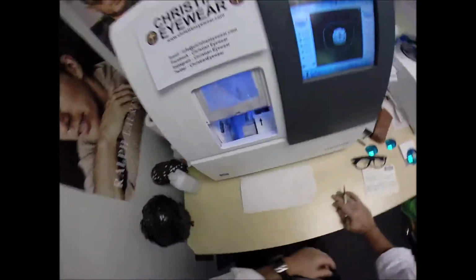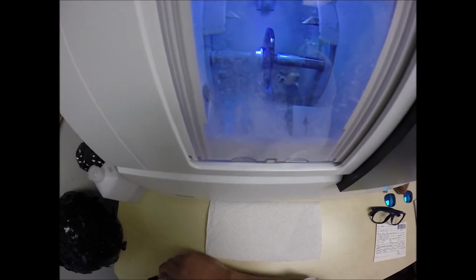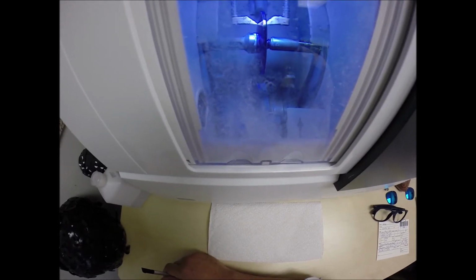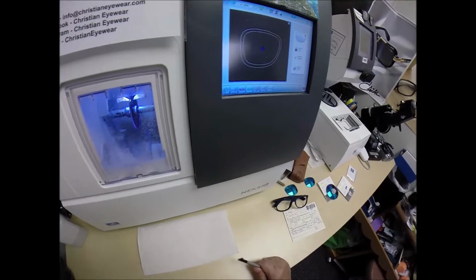So I'm going to hit the green start button. The dirty door closes. The clamp shuts. You think the door is dirty now? Wait a couple weeks. Secret Agent 2840. I'm gonna let this thing get dirty so you can't see through it. But it's tracing the shape of the right lens now, making sure it's large enough to go into the frame.